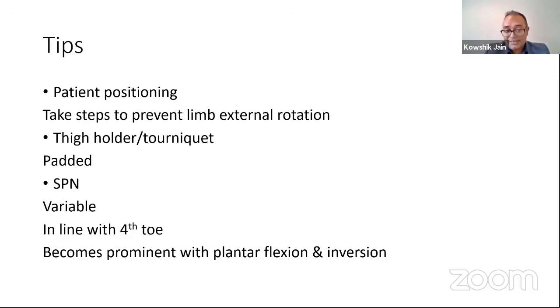Another tip I would say is don't double glove. If you wear two gloves, it's difficult to appreciate this cord-like structure. So with a single glove, you can easily appreciate this cord-like structure under the skin, and mark it following that.